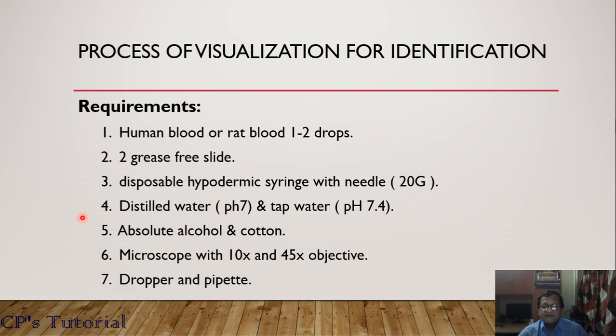Now the process of visualization and identification of the species, that is the identification of the blood smear, should be discussed.